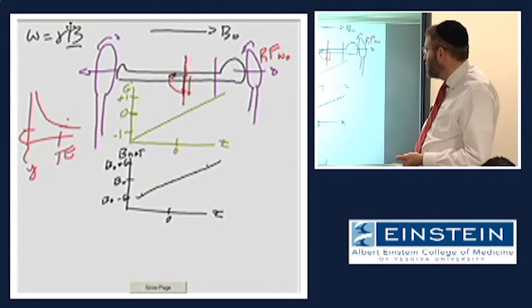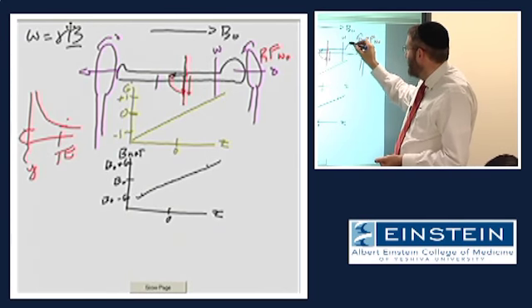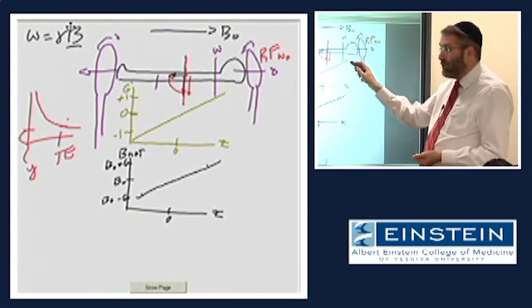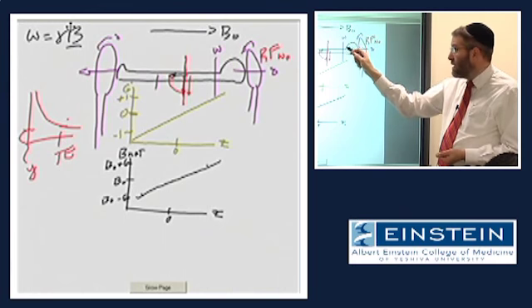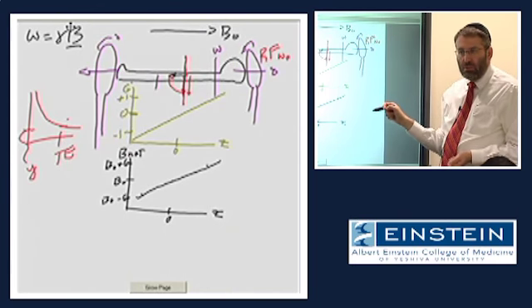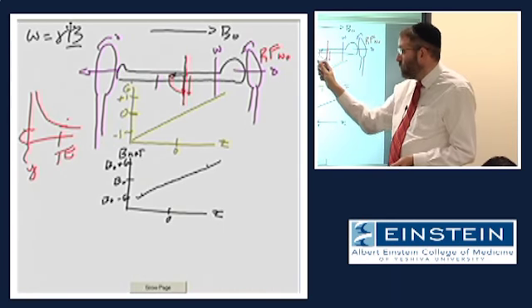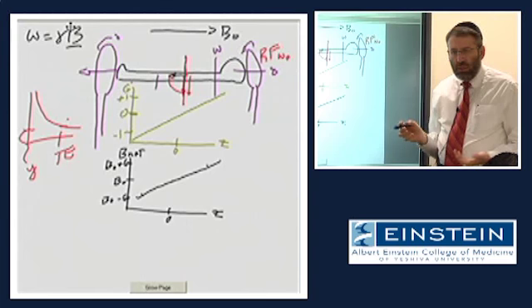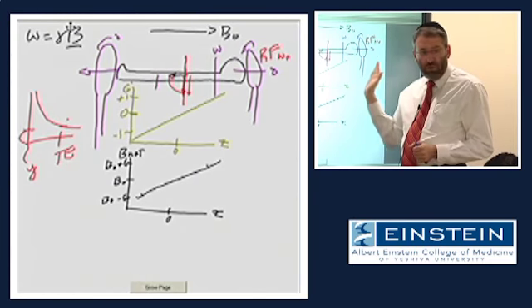And by simply choosing a frequency that matches that location, we can apply our RF at this frequency and excite the spins in a plane at this location. So simply by adjusting the frequency at which we transmit the RF, we're now able to select a slice essentially anywhere along this dimension.